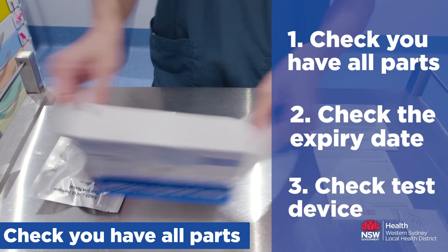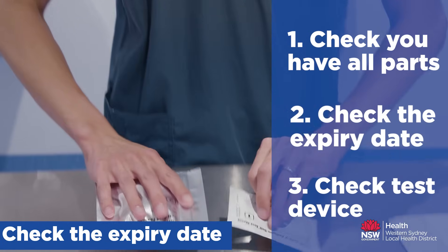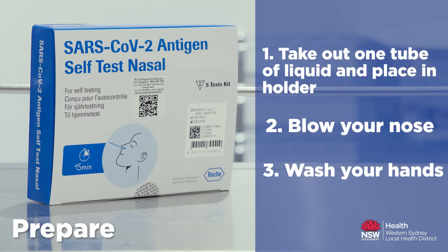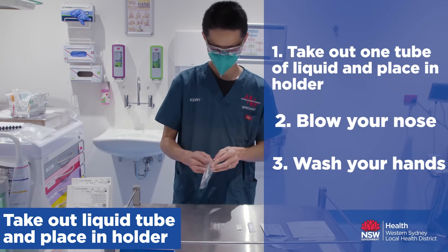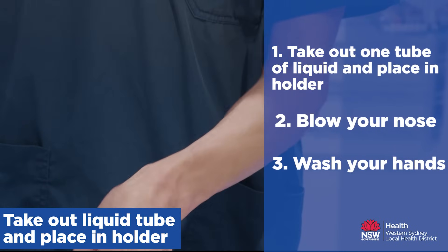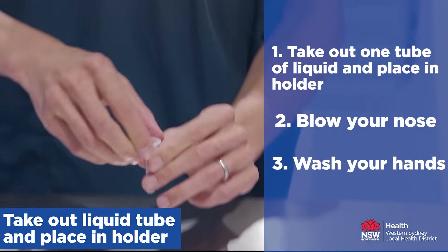Thank you for joining us. Take out one of the tubes with liquid and one nozzle cap. Open the seal of the tube carefully without spilling the liquid inside the tube.